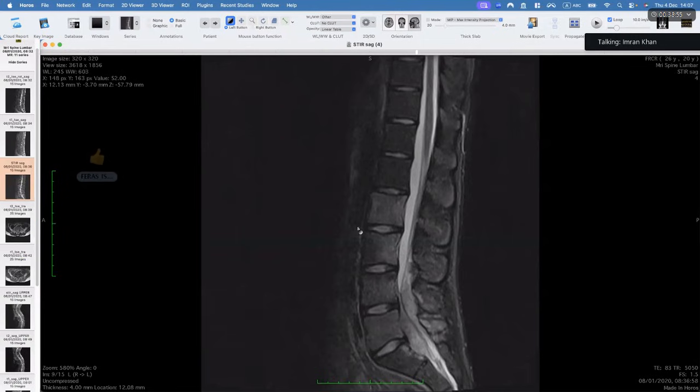The other diagnosis you can sometimes give, and it would be pretty reasonable as well, would be tuberculosis. But with tuberculosis, usually there's a lot more fluid component. There are no end plate changes in this patient, which would be more typical of TB spondylodiscitis. And even though you do see multifocal disease with TB, it's not as widespread. So this is very much like a lymphoma.